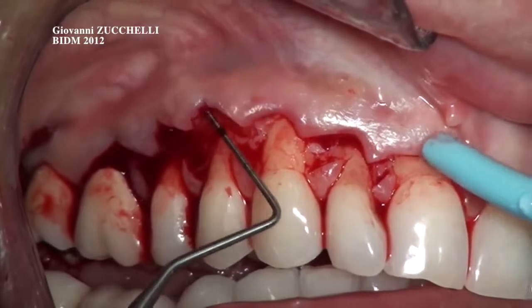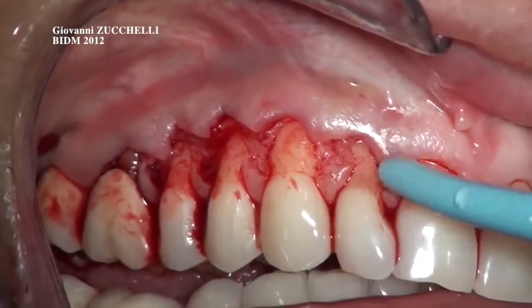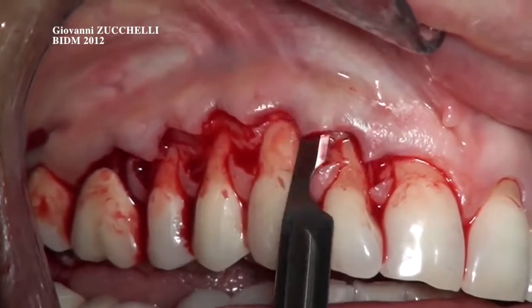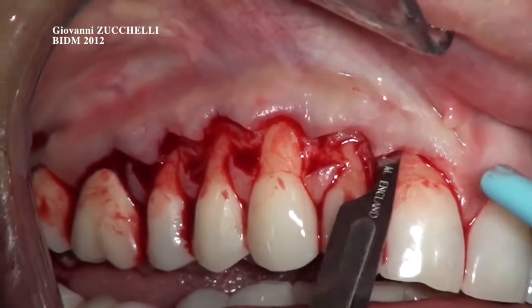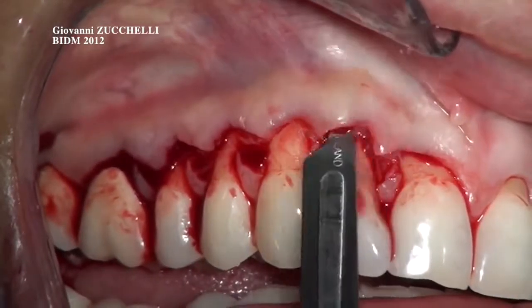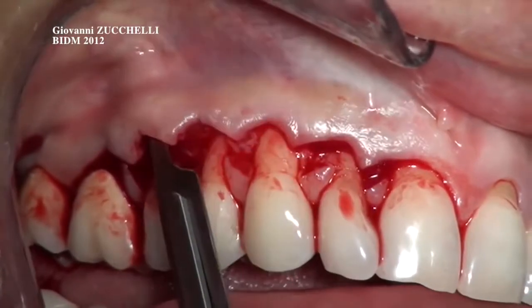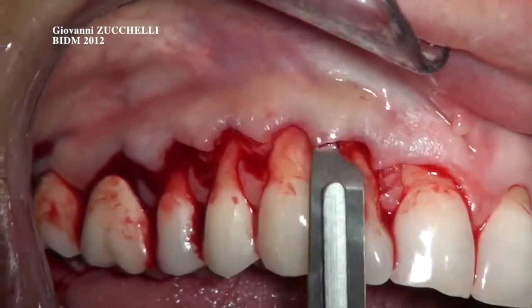Now that the deep insertion has been eliminated, it's time to go with the knife and eliminate the superficial insertions by taking the knife parallel to the lining mucosa, and you can see the movement of your knife through the transparent, very thin lining mucosa, and there must not be any interaction in this movement, and only if there is no interaction in this movement you will be able to coronally advance your flap in a very passive way.